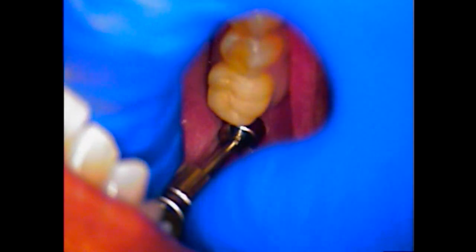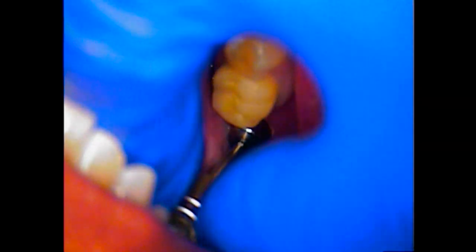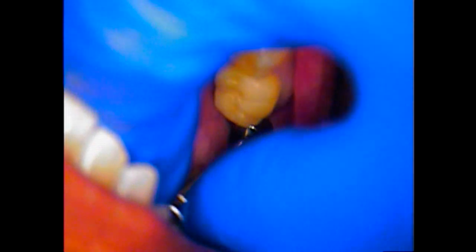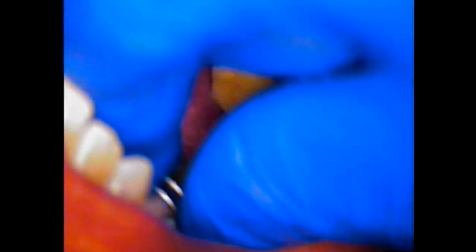And open nice and wide if you can. The wider the better. That's about it. Okay. There we go. And it's in.